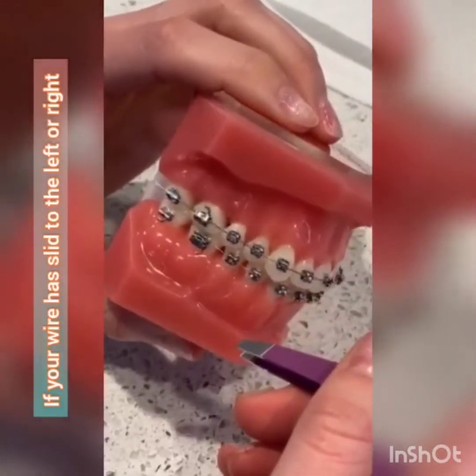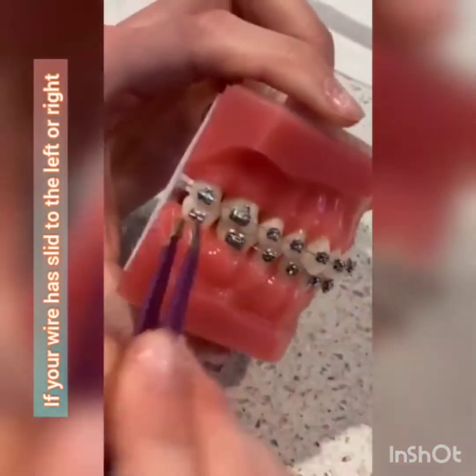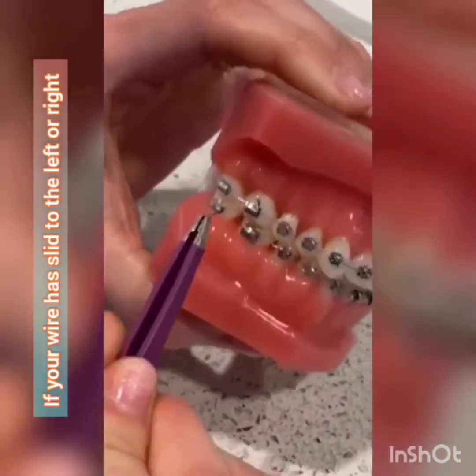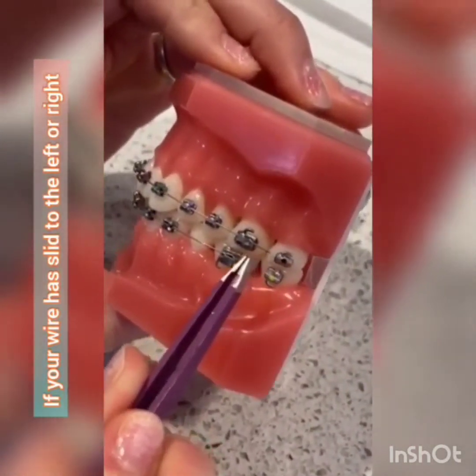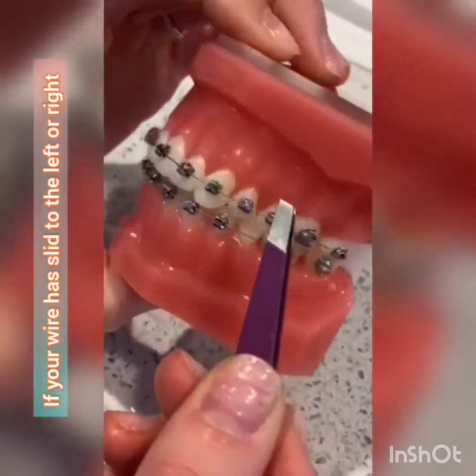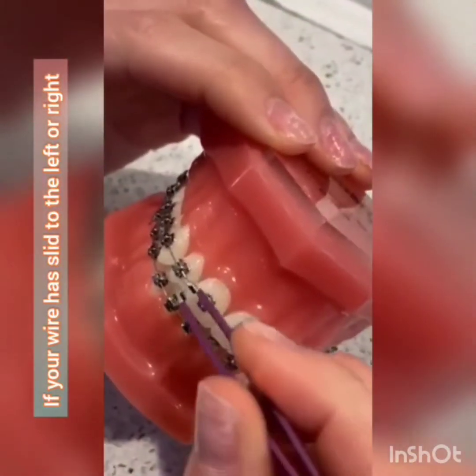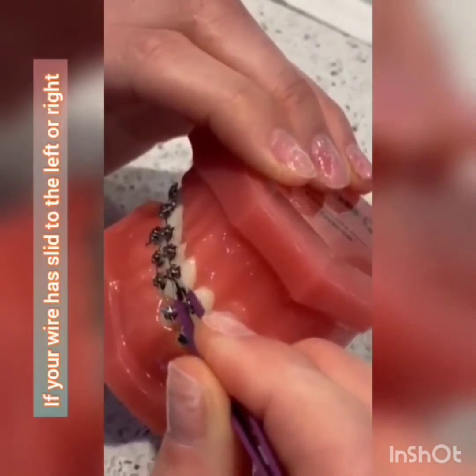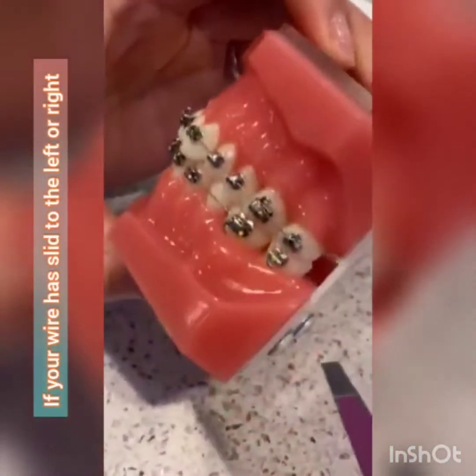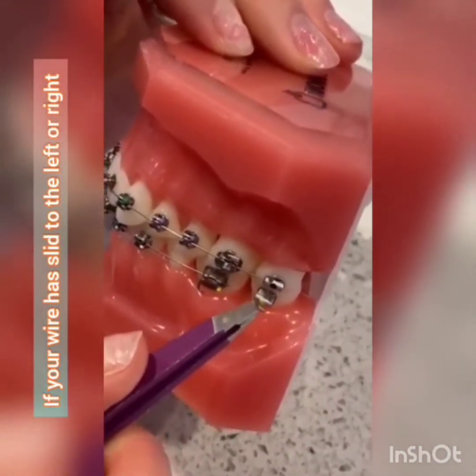So another common problem that you might have at home is that your wire actually slid to the left or the right. You can see that it's long on this side and then it's actually short over here because it doesn't go through that last bracket. So what you can do is take a pair of tweezers and slide it back where it needs to be. You're going to place the tweezers on your wire and just keep pulling in the direction that it needs to go. Same thing over here, making sure that it's going through the tube on the other side.